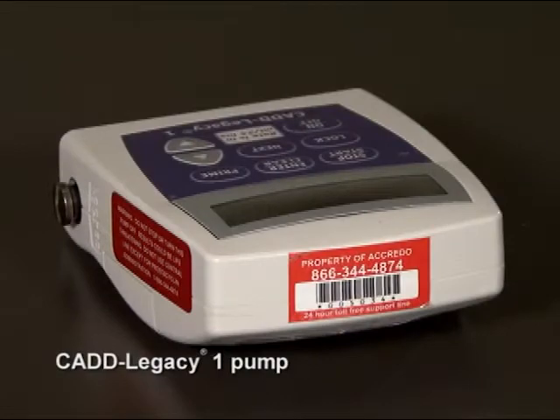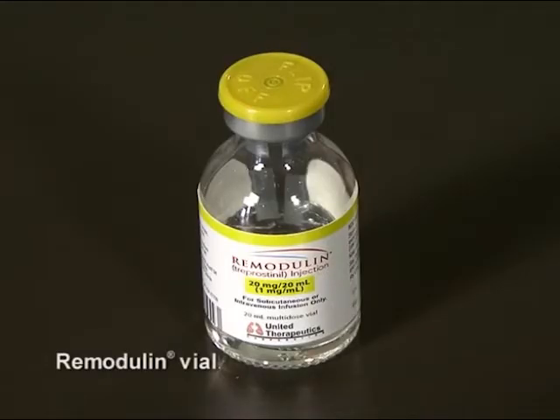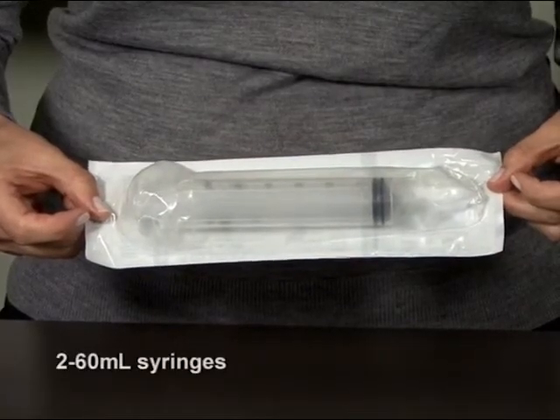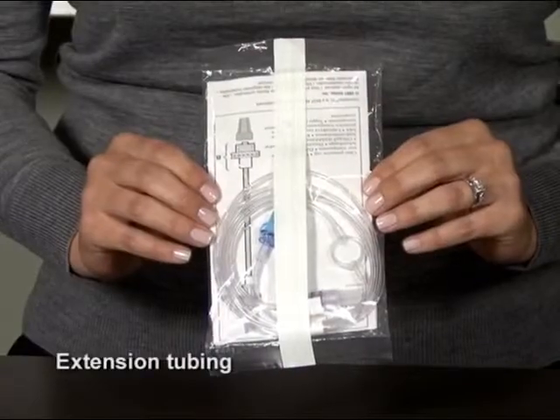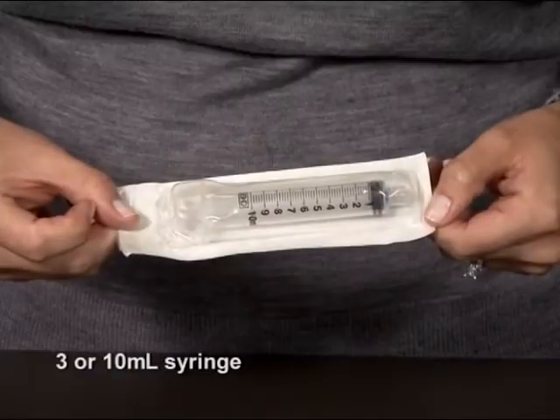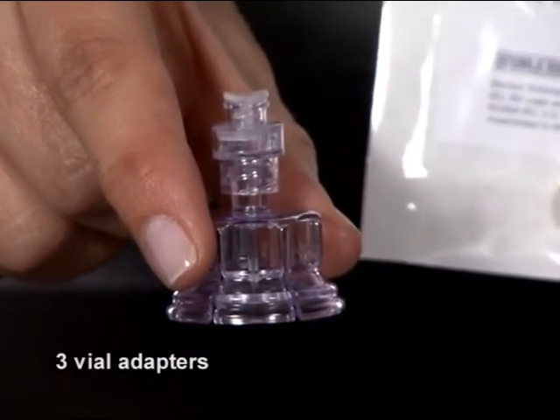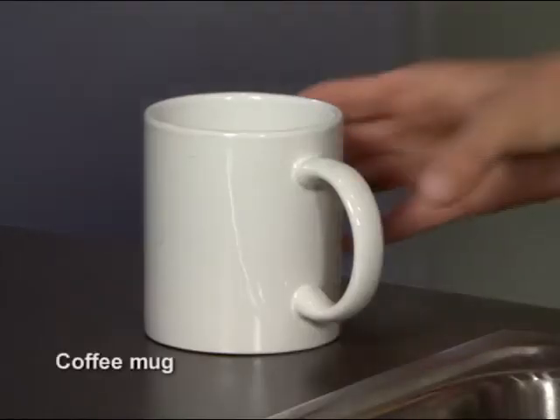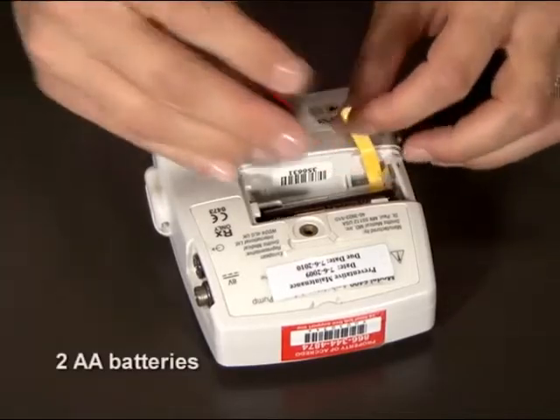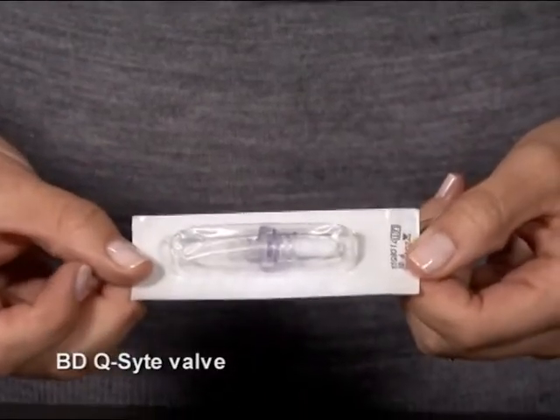Your CADD Legacy 1 pump, two 50cc vials of your prescribed diluent, a vial of Remodulin, two 60ml syringes, one empty 100ml cassette with a red cap, a 60-inch extension tubing with a filter, and a 3 or 10ml syringe. Or three vial adapters for drawing up your Remodulin. You'll also need several alcohol swabs, a sharps container, a ceramic coffee mug, two AA batteries — which you'll need to change once a week — and a BDQ site valve or other split septum type valve, which you'll also need to change once a week.